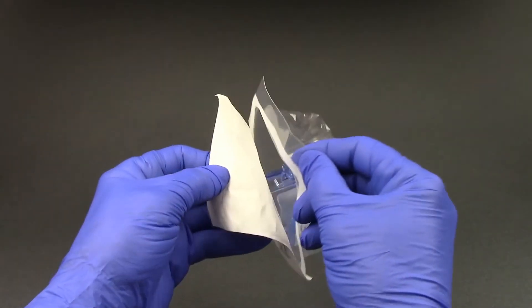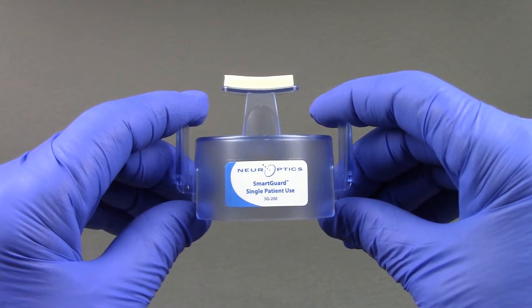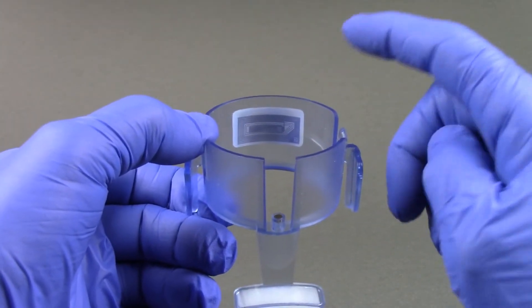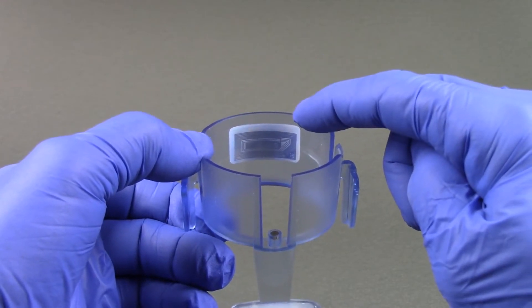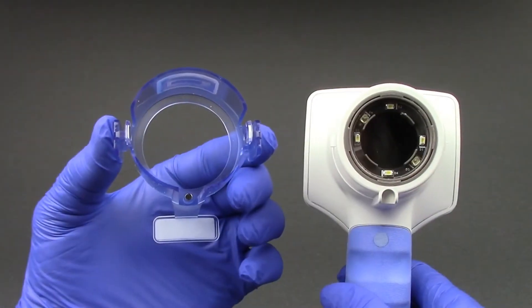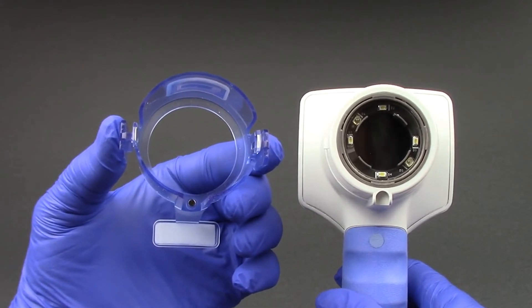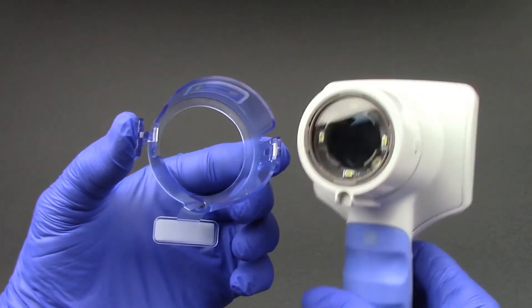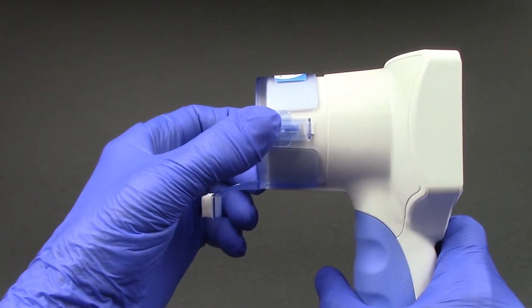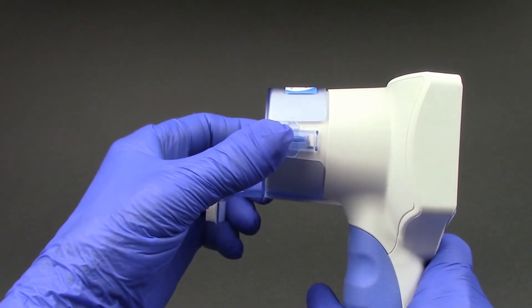Open a new disposable smart guard. The smart guard will be used on the same patient for the length of the patient's admission. The smart guard has an RFID memory tag that stores 168 paired pupil measurements, facilitating upload to the patient's electronic medical record. Attach the patient smart guard to the Pupilometer by placing it over the camera lens with the foam pad facing outward at the 6 o'clock position. Gently squeeze the smart guard side tabs to position it onto the NPI 200 Pupilometer. There will be an audible click when the smart guard is properly positioned.